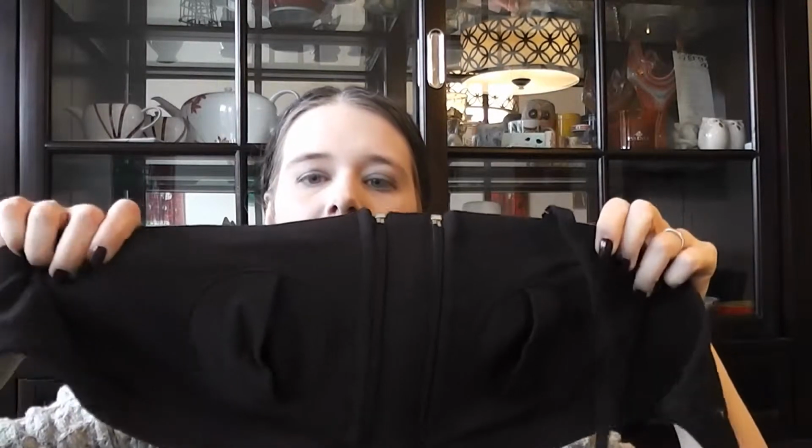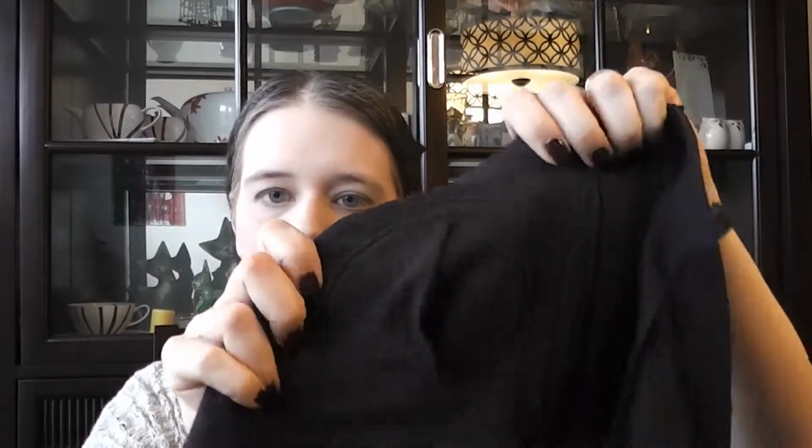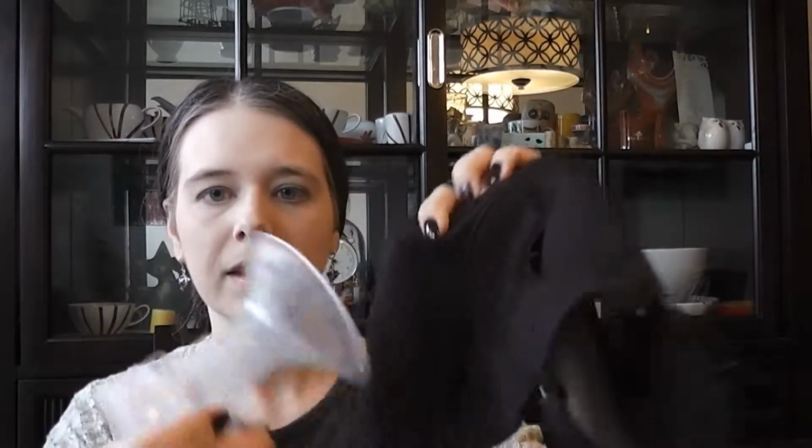I do use a pumping bra. This is the Simple Wishes pumping bra. And what this looks like is basically this long thing. It's got Velcro on one end, and you just Velcro it around. It does have straps if you want to use the straps, which I don't use. And then you have these 2 little thingies here, and let me actually show you how it works. So when you're wearing it, the pump thingy kind of slides in right here, and it goes through like that. So that way it's a hands-free pumping bra.